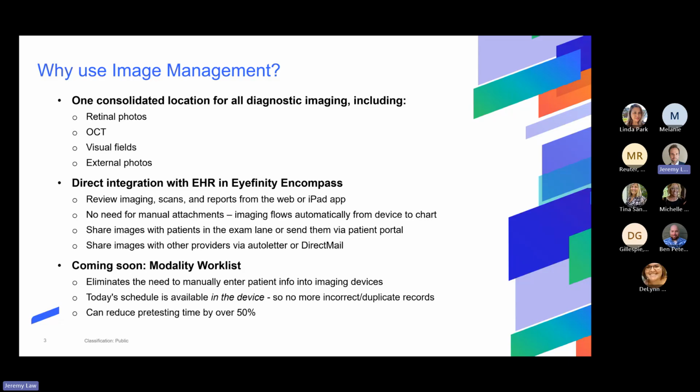I don't know how many of you have used those soft keyboards that come on the imaging device. Some are better than others. I have PTSD from when I was a technician, trying to enter patient information, trying to type in someone's name, and you hit the same letter and it doesn't respond, so you hit it again and again, and then it catches up, and you have to backspace, and it just takes a long time to enter patient information.